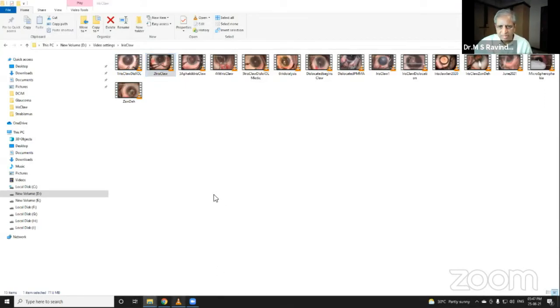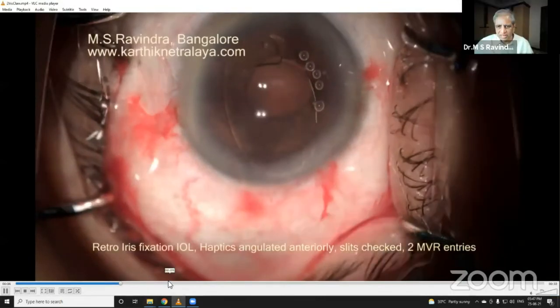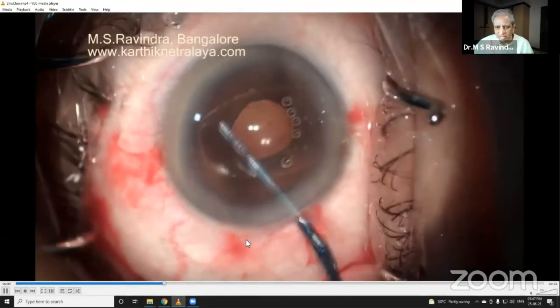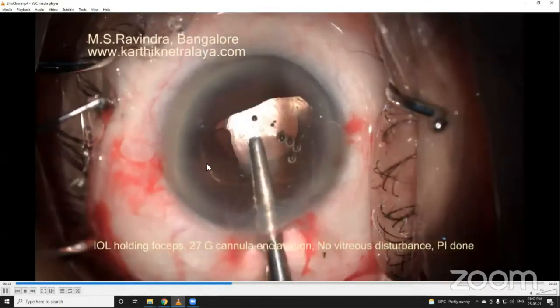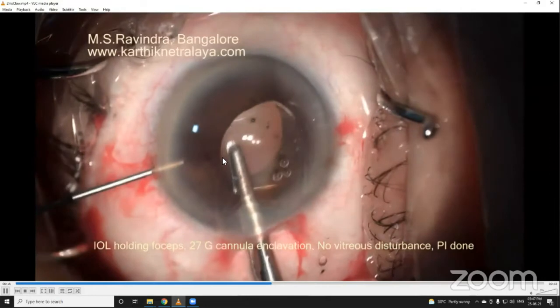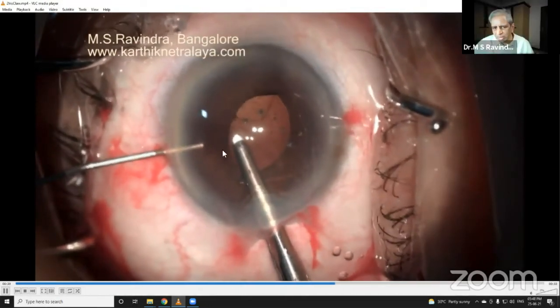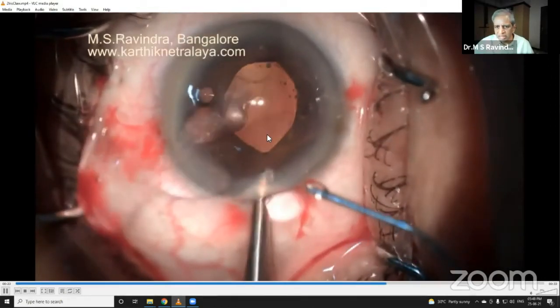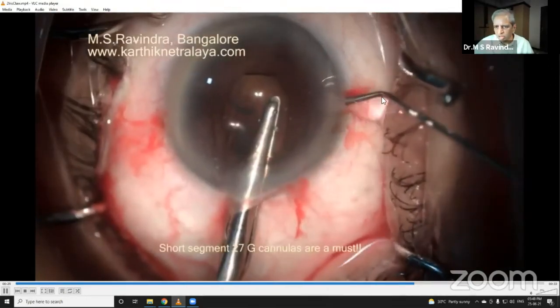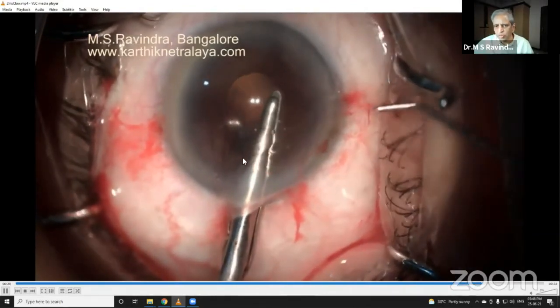Position it, hold — the moment you go, the viscoelastic comes out, the lens comes out. That's the time to hold it, take it behind the iris, lift it up, press at the middle of the flange. And again the other side — see, this is the cannula that doesn't touch the lid. Enclave it — that's the end of surgery. Remove the viscoelastic.